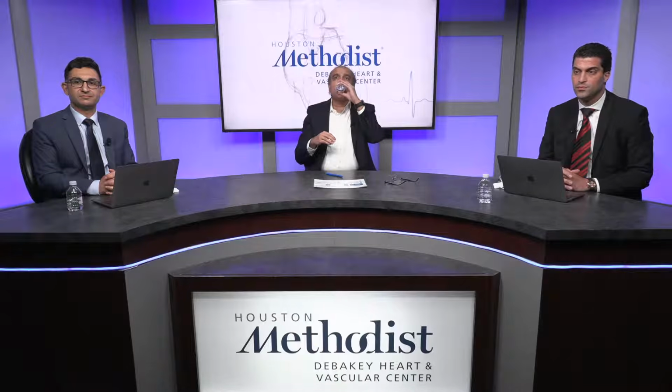Dipan, this is Steve. I can ask if you don't mind. Yes, go ahead, Steve. So, Payam, the cases are tough, and I think Dipan asked the important question: what's the role for a screening CT? The preclinical case is not so much the concern, right? I haven't had a TIA or a stroke, but an echo shows some gradient change. Those are the ones where there's really the big question. Who gets a CT at 1 month, at 3 months, at 6 months? Because like you said, most of these HALT events are within the first 12 months.